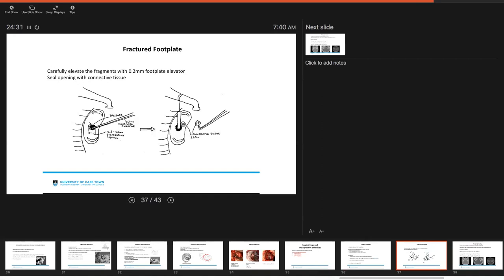These are some images of fractured stapes foot plate. If this occurs, you might try to carefully elevate the fragments with a 0.2 mm elevator and then you want to seal off that opening with some connective tissue.